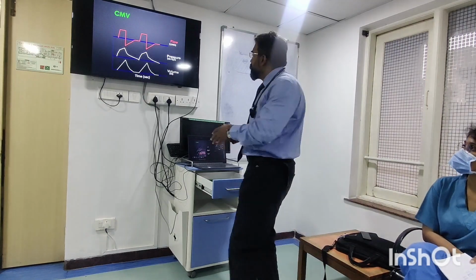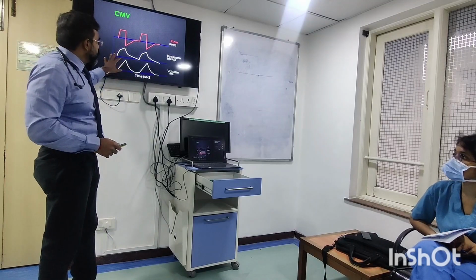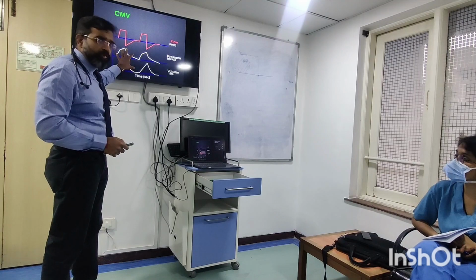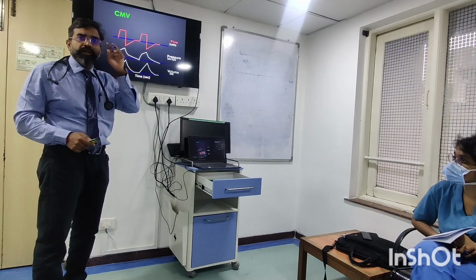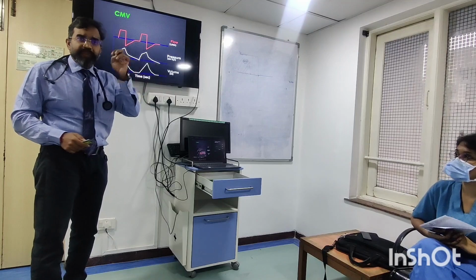Right? Now, in this flow, pressure and volume, when we talk about volume control, or for that matter, control mode of ventilation, I'll explain to you the first mode, trigger. Now here when I'm saying controlled mode, I'm not really dependent on patient's trigger at all. If the patient triggers, I need to have a negative pressure, isn't it?